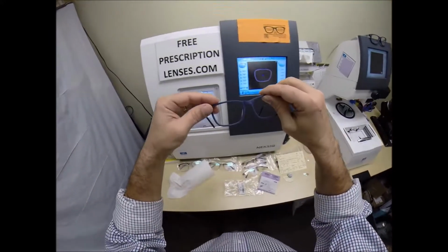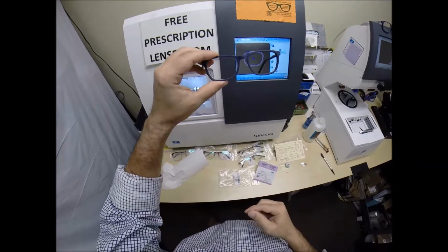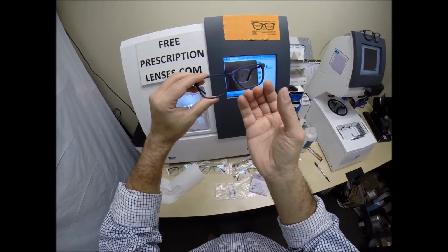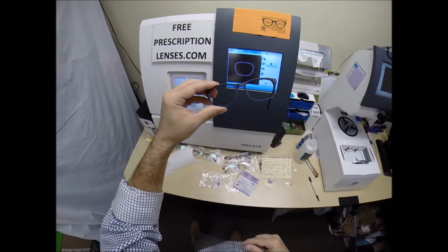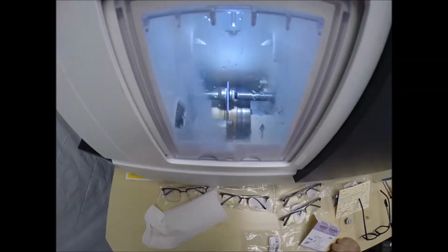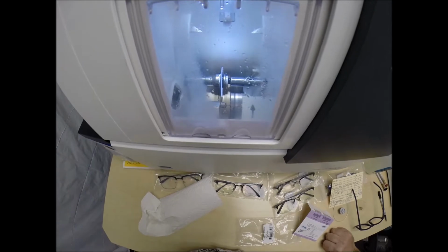I do not want to force the lens into the frame. It could cause it to stretch, or what we in the industry call roll. If you can imagine the bottom of your frame being like a gutter, if the lens were too large, it would force the bottom of the frame to roll outwards, giving you an ugly cosmetic look as well as shortening the life of your frame. So we don't want that. I cut every pair of lenses that get shipped worldwide. So you want a perfectionist like me cutting your lenses.